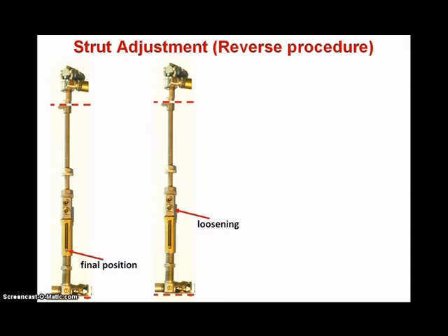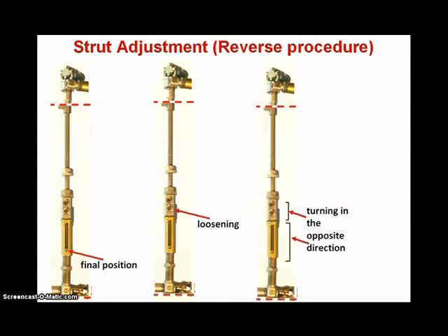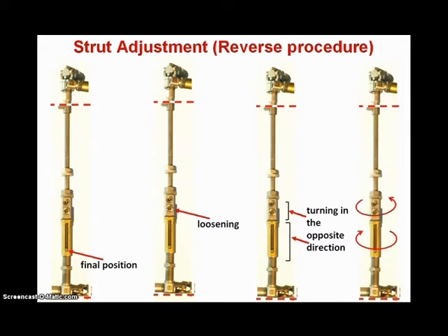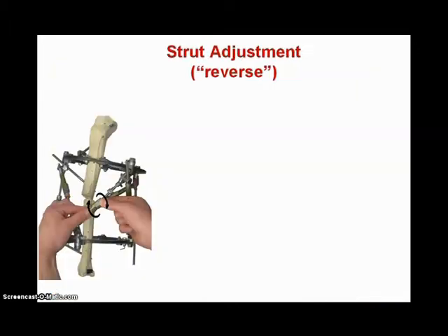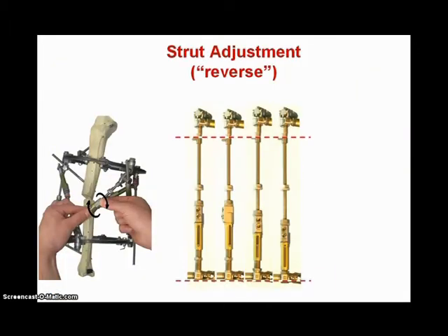You see the indicator of the strut's length. To make the possibility of further lengthening the strut, it is necessary first to loosen the second screw, which is close to the yellow cylinder, and then to turn the gray part of the strut's length changing unit and yellow cylinder in the opposite directions. You see how it is made, and here you see that the strut length remains the same.